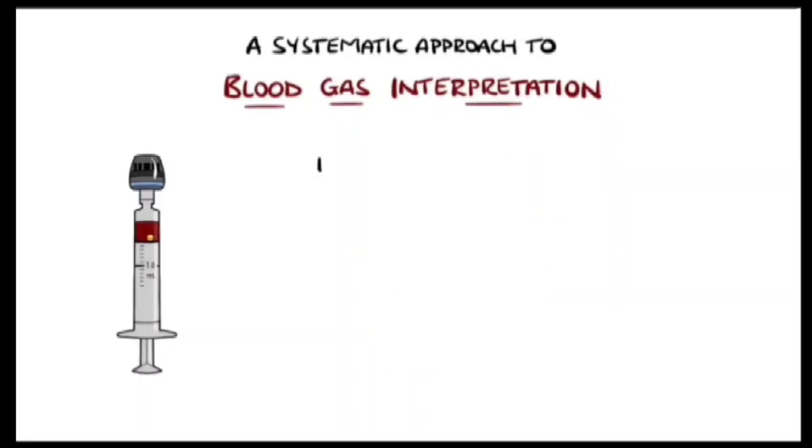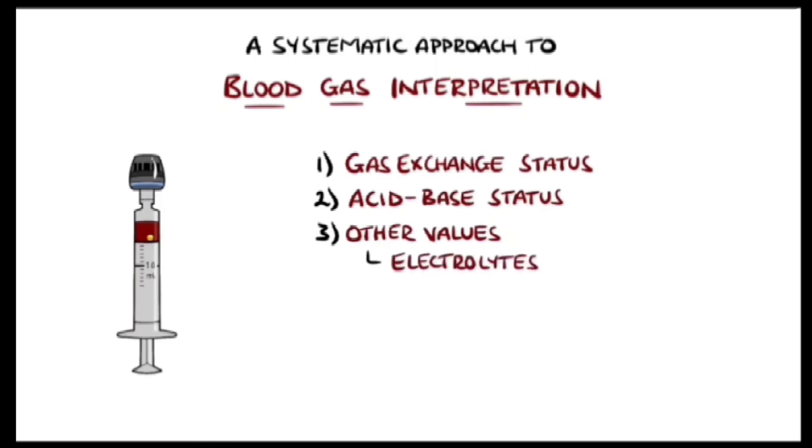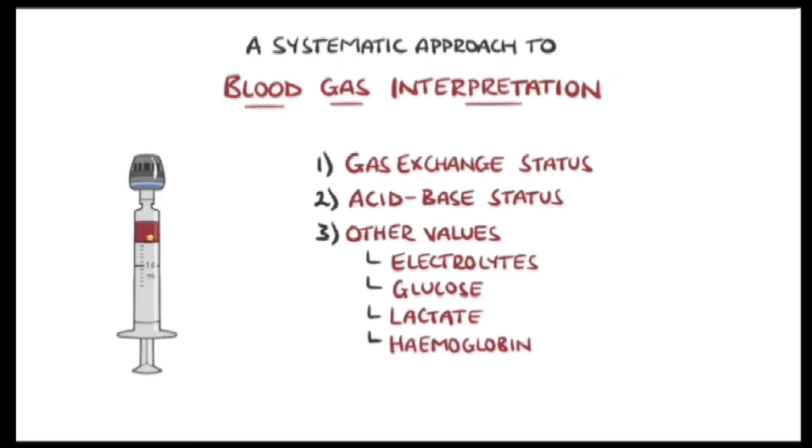status of the patient and can give a preliminary indication of other values as well, so they are a very useful test in the acute setting. As with most investigations, the first step is to confirm that your ABG is that of the correct patient. This includes the date and the time and any previous blood gases to compare with.